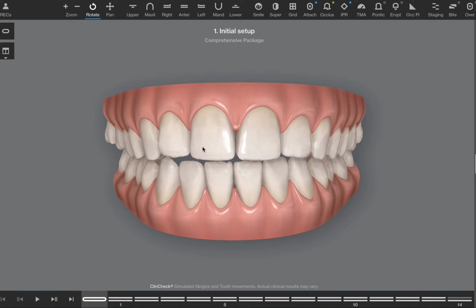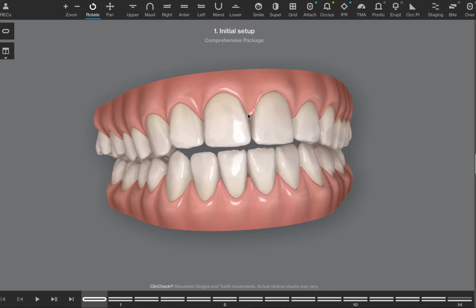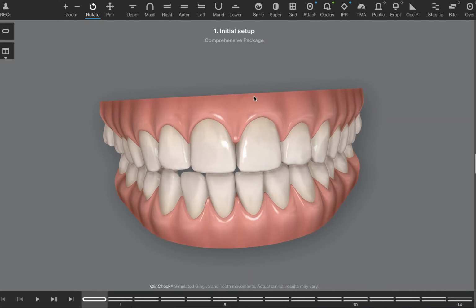Okay, so what I'm looking at is how the lips in your face sit around the teeth. I don't think we need to change anything. If we pulled these down, I don't think it would look as good as it could if we just left them where they are. I would like to bring these teeth back here up a little bit to make everything nice and level. So we have some aesthetic things to do.